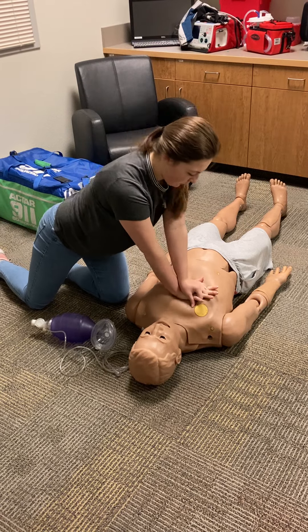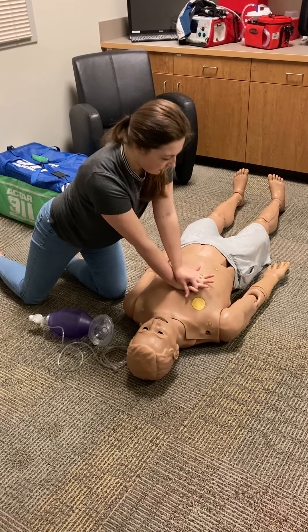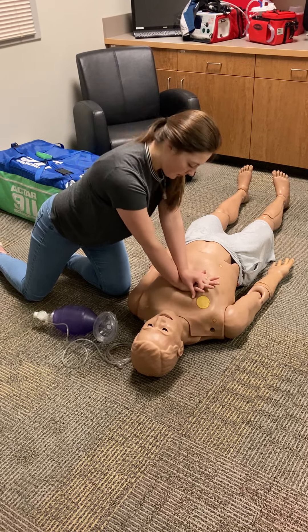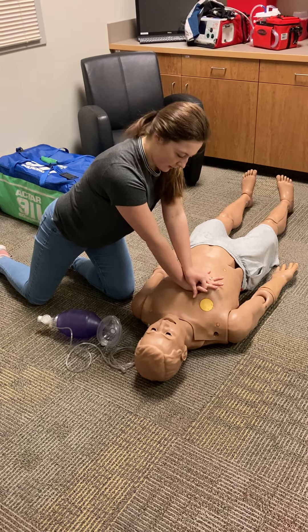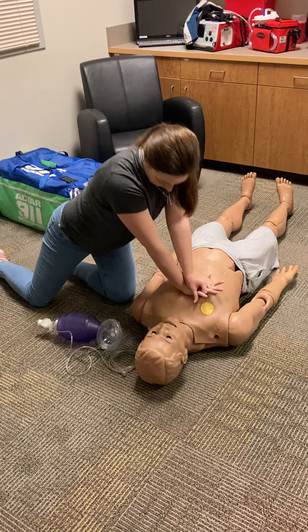Checking breathing and pulse. I'm not getting a pulse. He's not breathing.